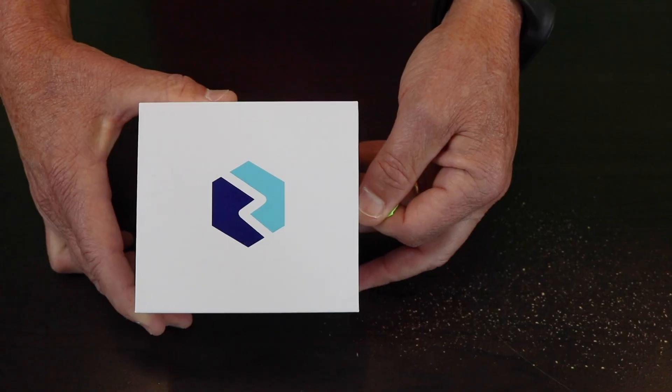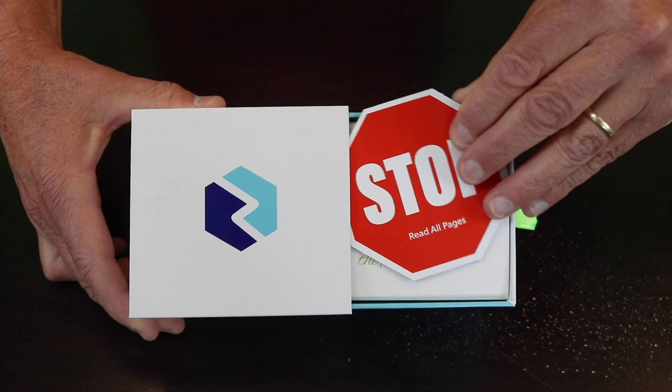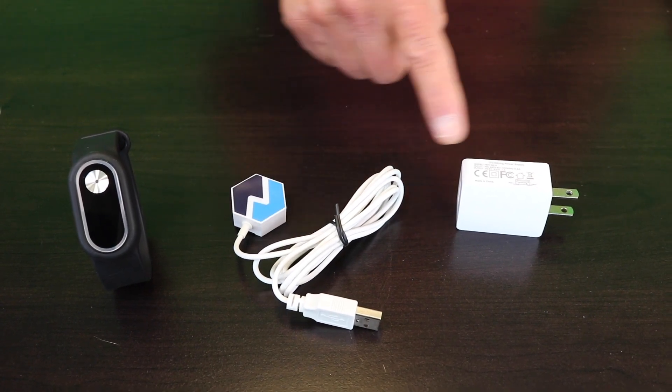Thank you for purchasing the Nimbus CM2 Pulse Band. I want to show you what you'll find inside this box. The first thing you'll find as you open the CM2 band is this stop sign — make sure you take time to read it. There are three components in the box: the band, the connecting cord, and the wall charger.